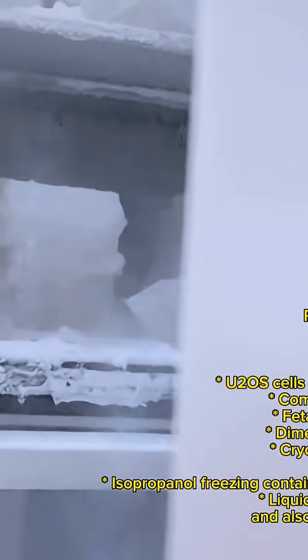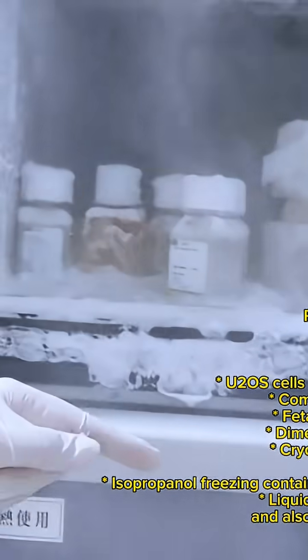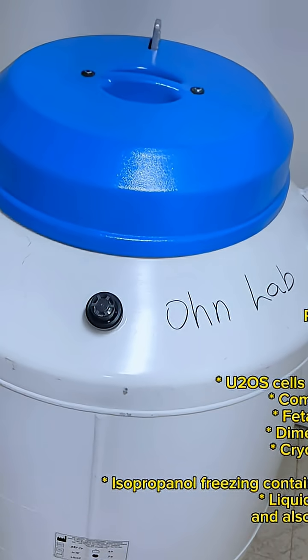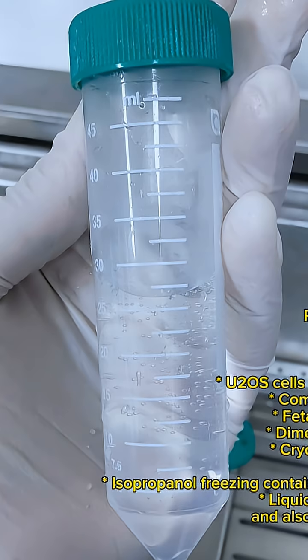You'll also need an isopropanol freezing container, such as Mr. Frosty, or a controlled rate freezer, liquid nitrogen storage tank, and also PBS and trypsin EDTA.